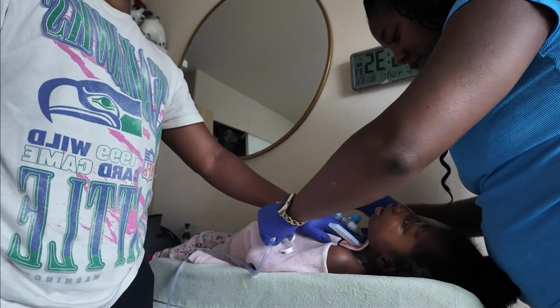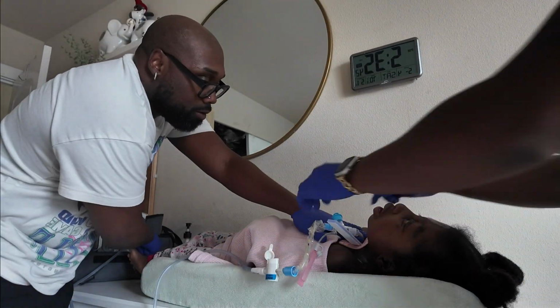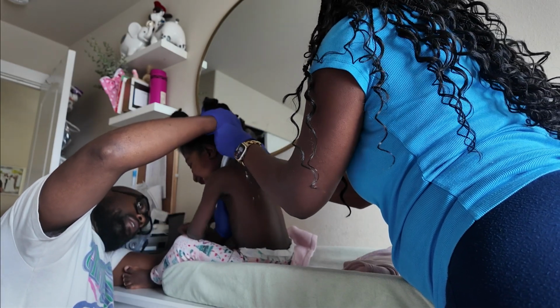Another suction. We always do one good suction before we sit her up. We take the catheter off, and now I'm going to tighten the ties, okay? So we're going to secure them around her neck. My husband is having both fingers around her trach area. He's using one hand to support her hair just in case this gets in the way.